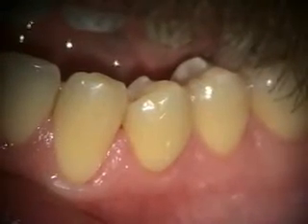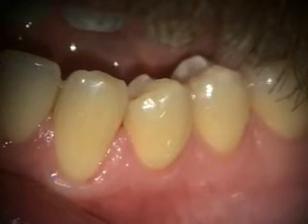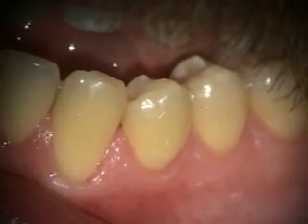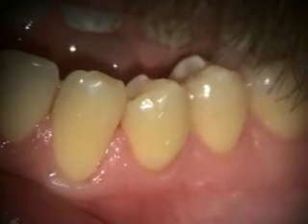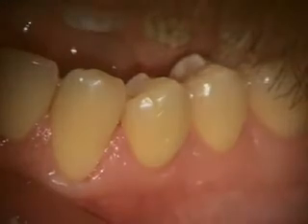This is a two-and-a-half-year follow-up of the grafting on the facial of number 21, where he had root resorption that we plastied out and then coronally positioned with alloderm underneath. Looks real stable. Everything's real healthy.